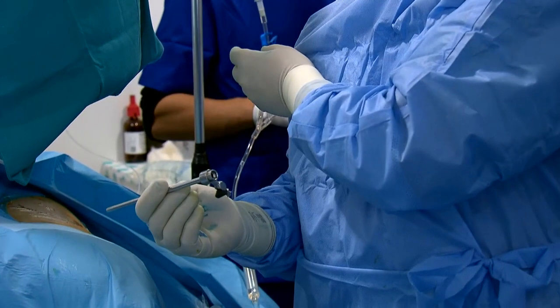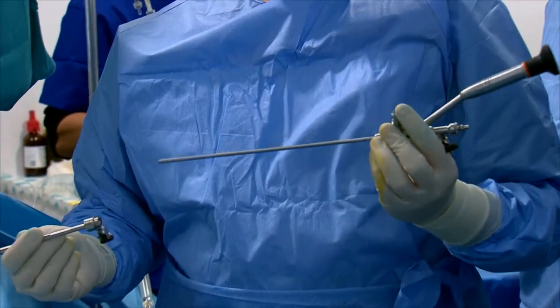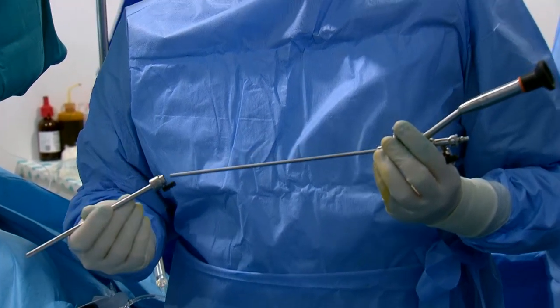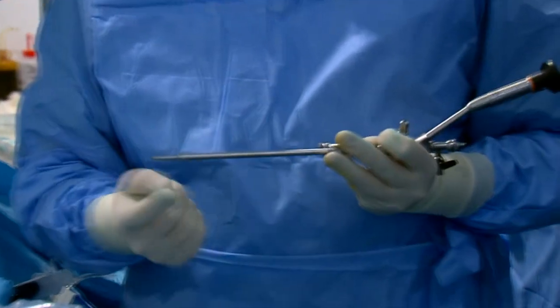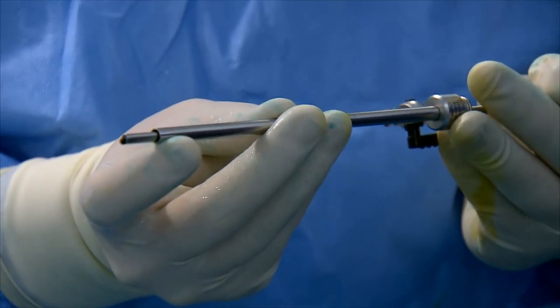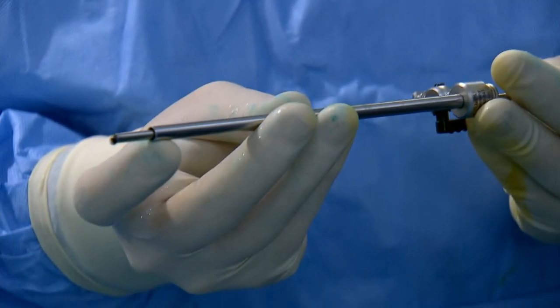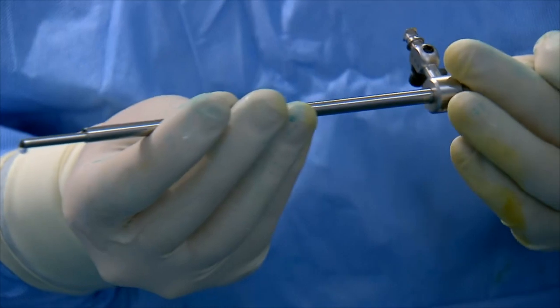The next step is to have a view with a mini nephroscope. The mini nephroscope has a diameter of only 12 French, and inside the Amplatz sheath you have a diameter of 15 French. This means that the nephroscope is not in a fixed position. If you focus your camera on the tip, you can show this. There's a certain space between the nephroscope and the Amplatz sheath, and this is a space where all the small fragments migrate automatically out of the calyceal system. The effect is called the vacuum cleaner effect. This is the principle.